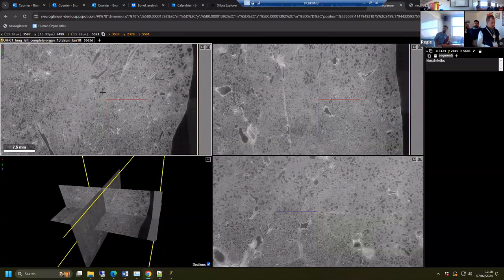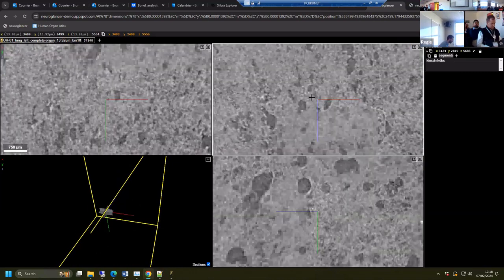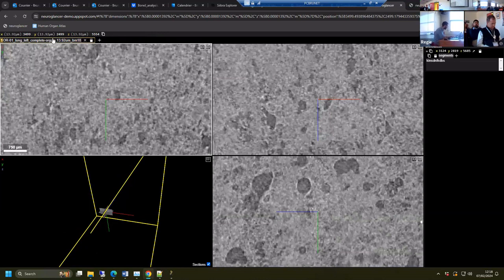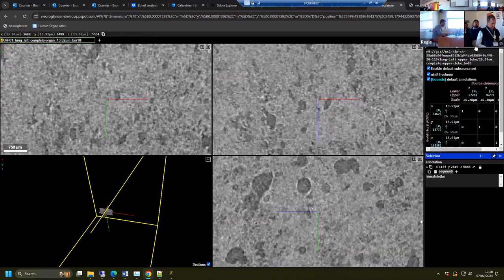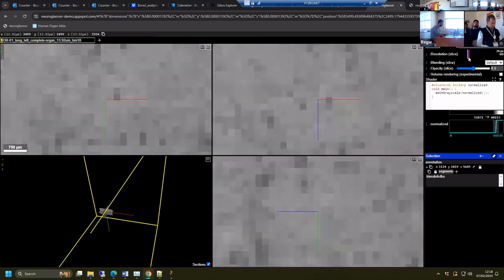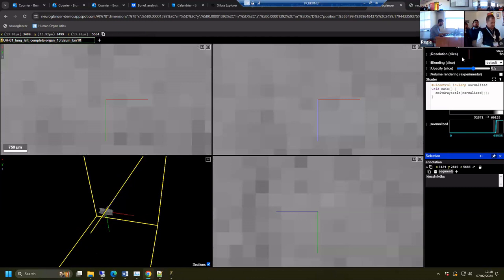So it's in a N5 format. It's a hierarchical format where the resolution you see is adapted from your zooming. So the more you zoom, the more details you will see. If I zoom very high, normally the resolution will adapt. Yeah, exactly like this. And you can see here that you have all the different bins. So here full resolution, and here is quite binned.